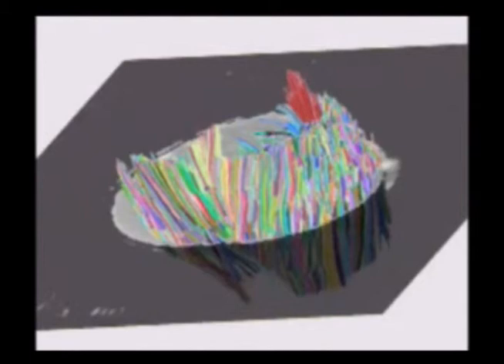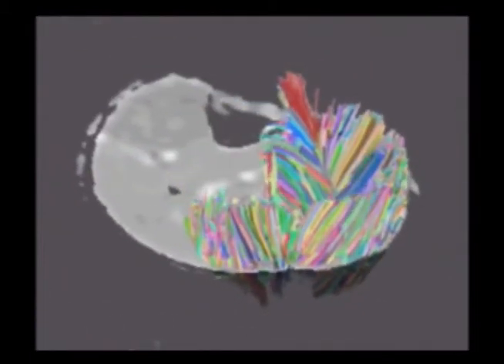In the brain, we can look at where tumors will erode into the fibers or where they push the fibers aside. In the leg, we can look at these as well. This is the bipinnate nature of the gastrocnemius right here in the lower leg. That's the tibia right here and the fibula. Nice parallel lines of these fibers. They're just randomly colorized for no apparent reason, just colorized so you can see them.